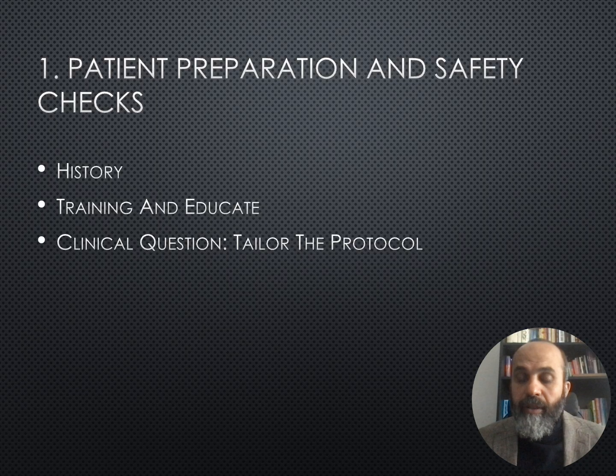Starting with the first one, the more you invest in the room, taking history, the better. We are all radiologists struggling with the clinical history that is missing. It is not telling us the entire story. Clinicians are sending us about 50% of the story, and the other 50% lies with the patients. So talk to the patient, invest time in the scanner, train the patient, and educate them on what is expected, especially if it's a stress study, and what experience they will have.